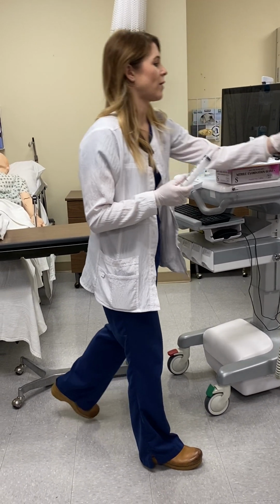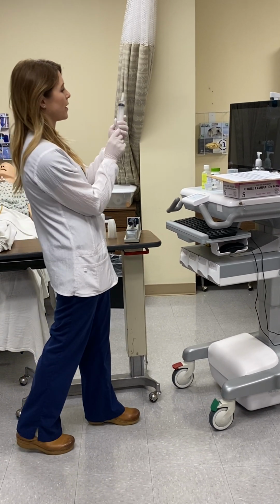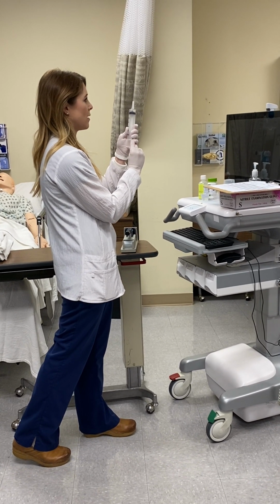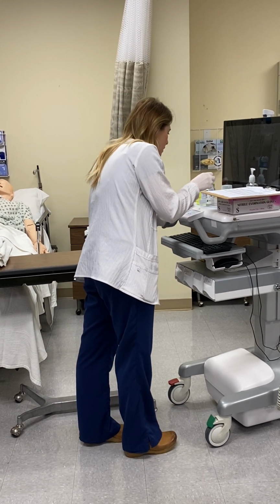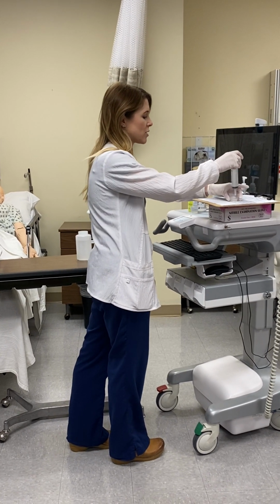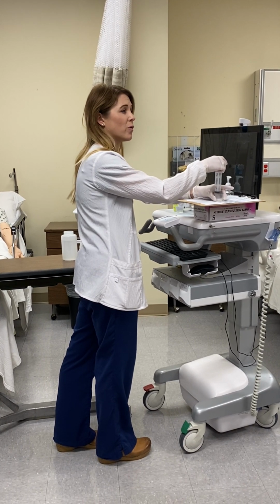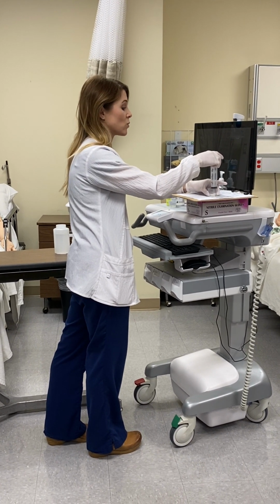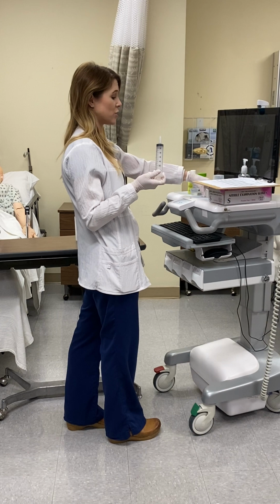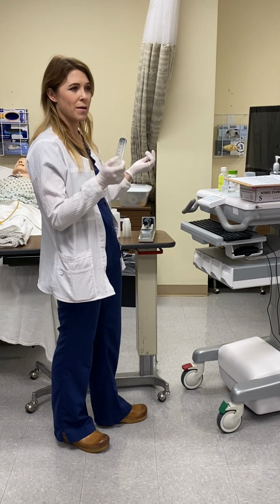Okay, I'm going to take note of how much intake I'm about to give the patient. So I'm only going to get a little bit of liquid in here. Let's say I got, being very precise, 10. I'm going to put 10 to 15 mLs with each med that's crushed. Typically I'm not supposed to use the tip of this if I'm giving a bunch of different meds, because if they're not compatible, I'm contaminating each med. But because I'm only giving this one and it is compatible with the multivitamin, I'm utilizing the syringe to stir it. You see now it's stirred very well, but by the time I get to the room, it could settle on the bottom, so I may need to do that again.